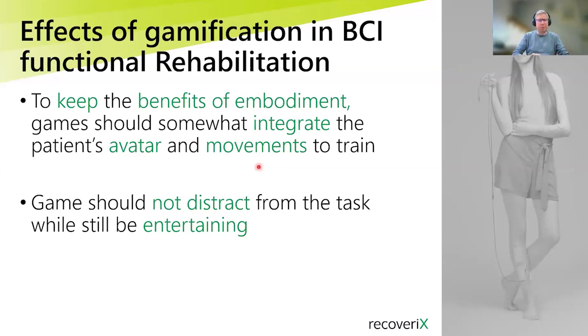We also had this in the talk before. You saw the hands throwing these balls. Here also in our games, you still see your hands or your legs, depending on the rehabilitation task. And also the game should not distract too much from the task.